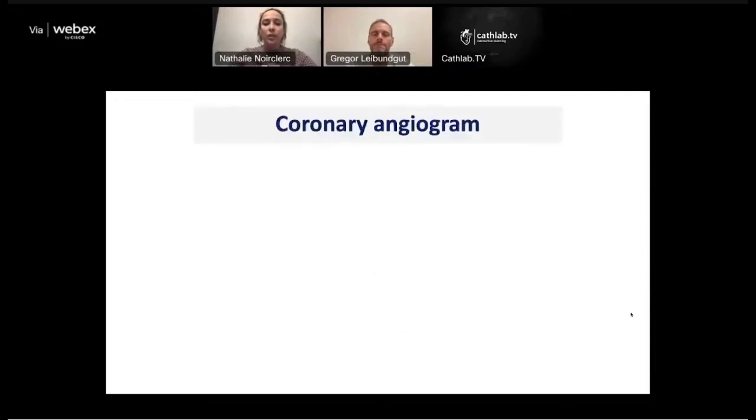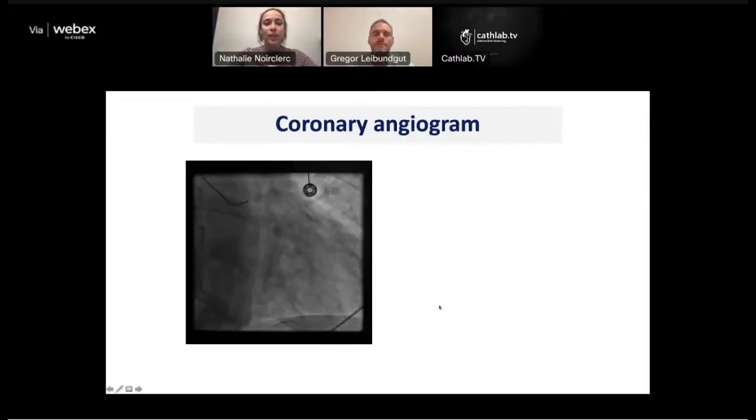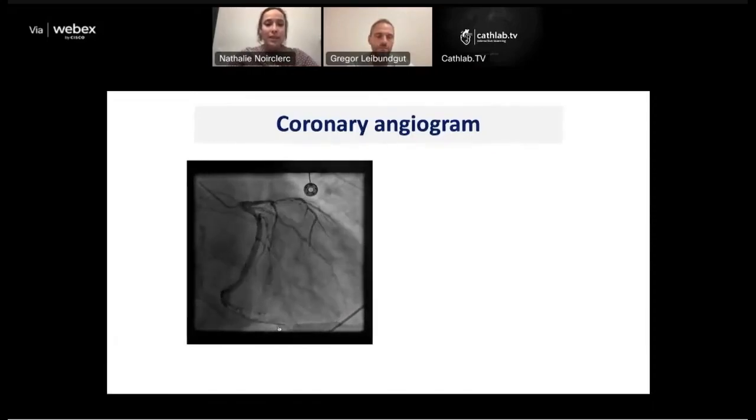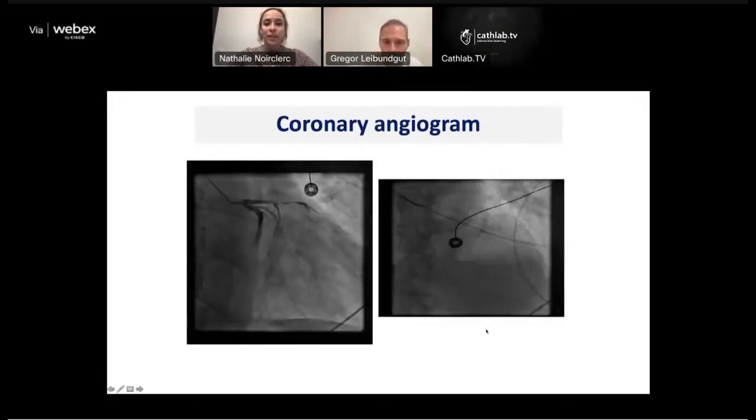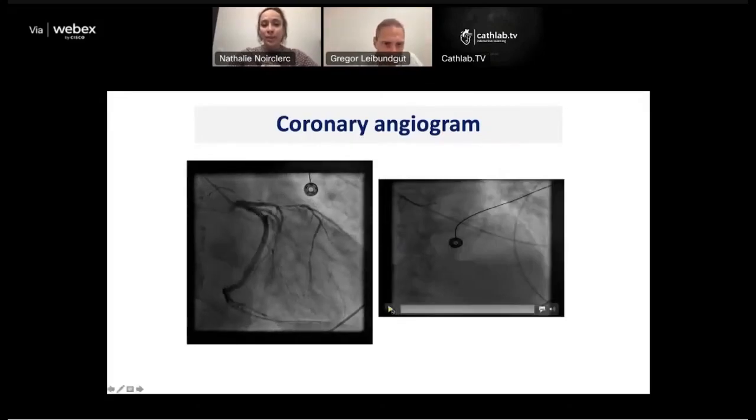That showed a troponin rise, so he came for the coronary angiogram. We are going to see only the left network because it's left dominant, so I didn't put the right. You can see that there is a significant in-stent restenosis on the LAD. So it was a Friday afternoon. I thought, okay, fine, very quick, balloon, stent, and I'm home. But unfortunately, it's absolutely not what happened.